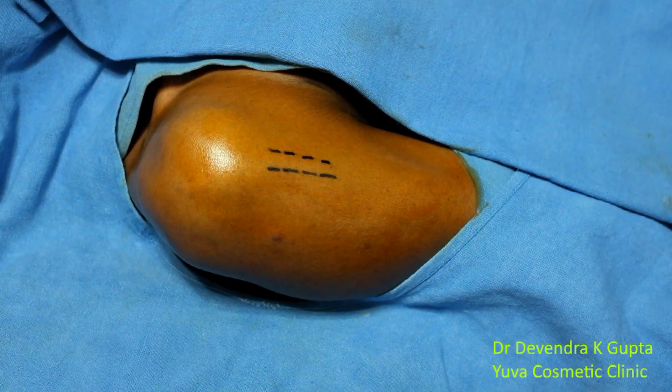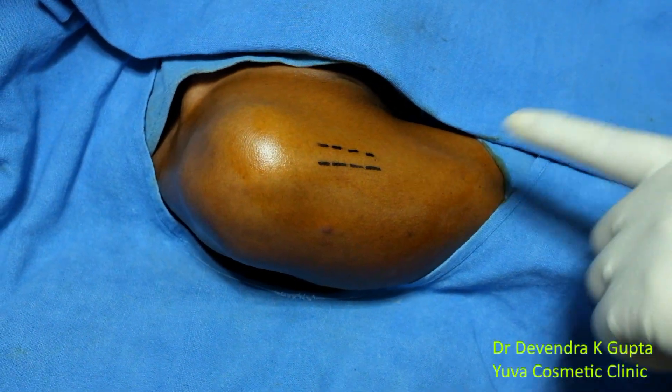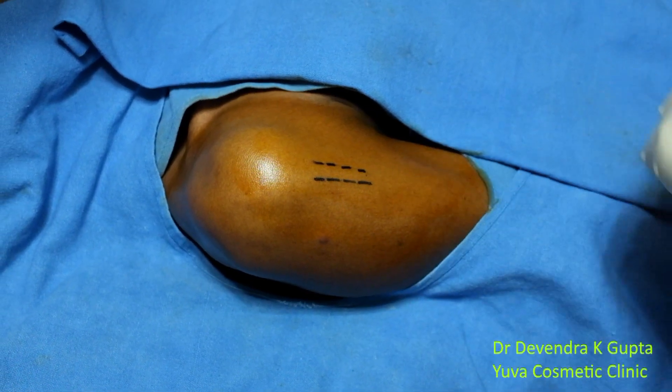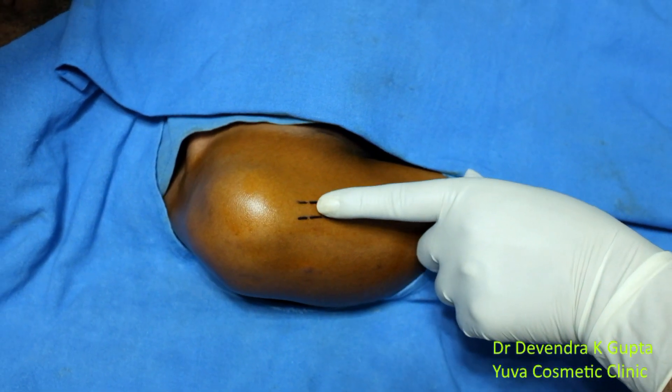The patient is 40 years old and complains of pain in his right shoulder. I have marked the area with a dotted line that represents the bicep tendon here, and if I palpate this area, he says there is a lot of pain.